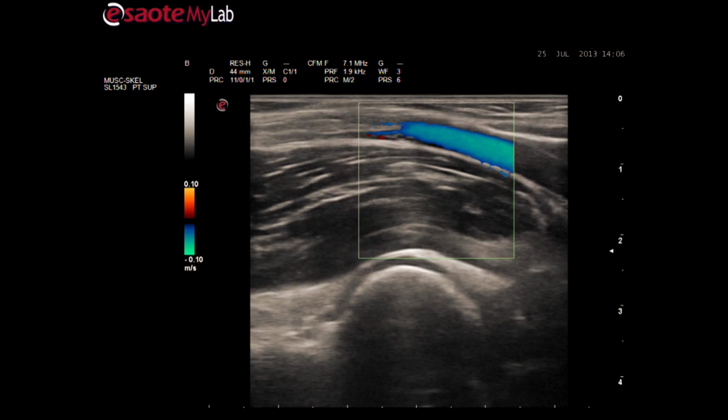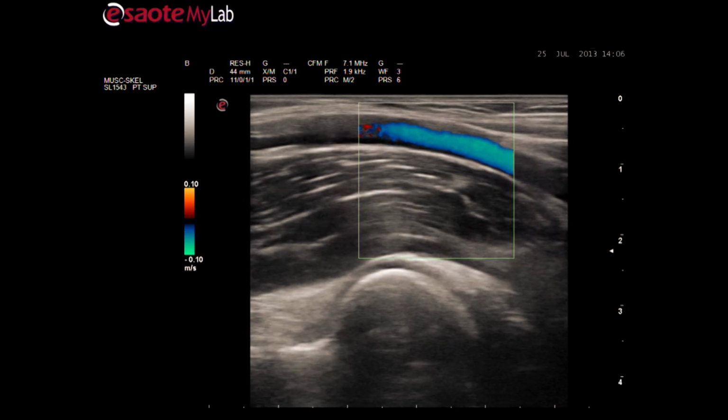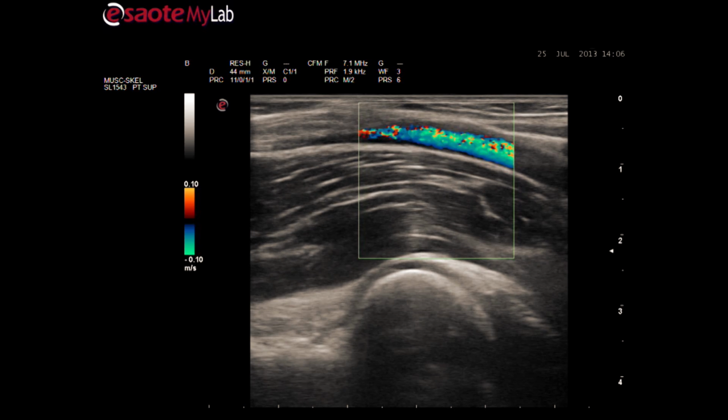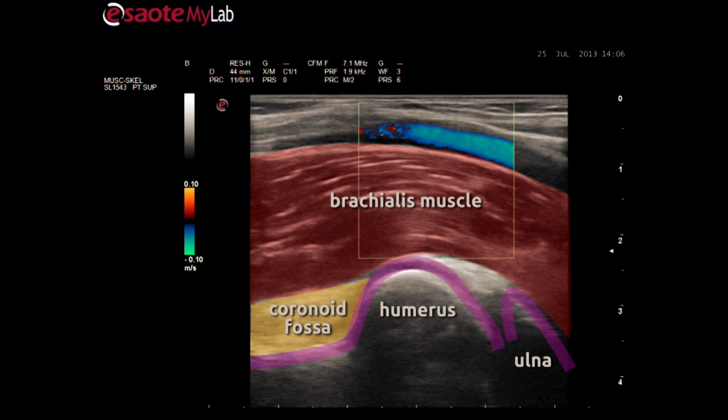Now all soft tissue structures can be seen in their full length. At the top, the brachial artery with the underlying brachialis muscle. See the beautiful fibers inside the muscle. Underneath the brachialis muscle, we can see the elbow capsule, in white, and the underlying round-shaped trochlear bone. Left from the bone, we can see the coronoid fossa. Right from the bone, we see the coronoid process.